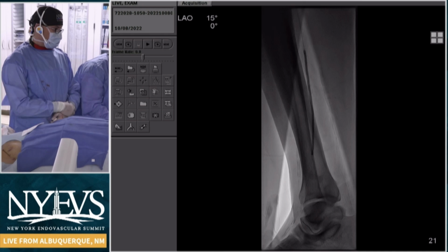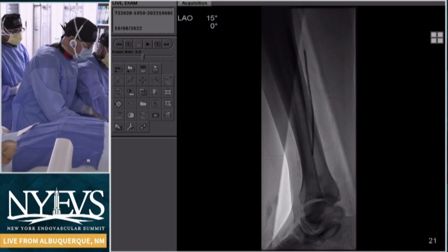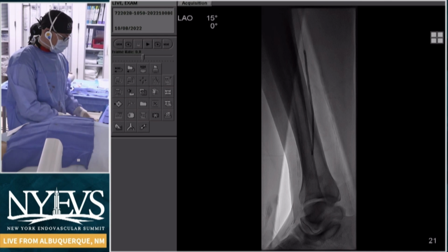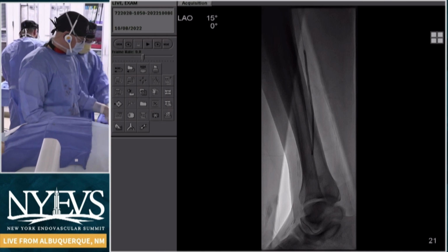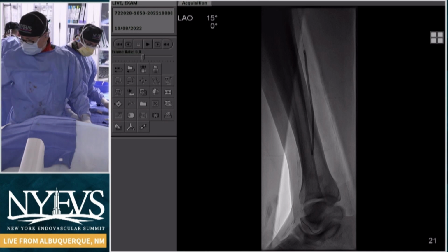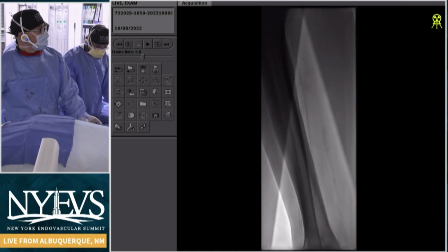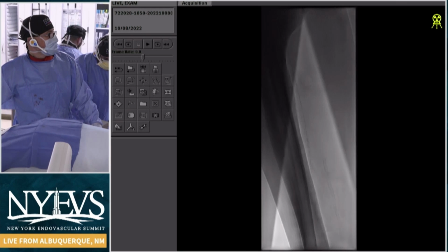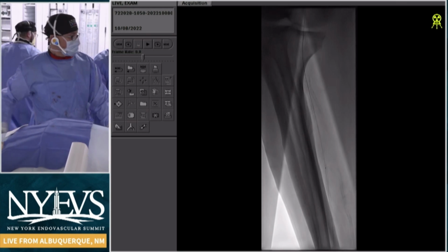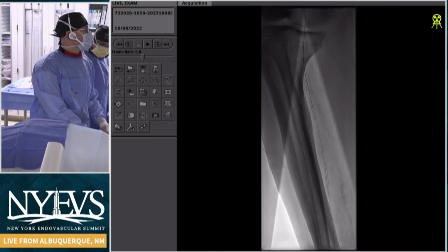We really have started to utilize PAT, as we're going to discuss later. It works well and has given us a good guideline. I'm big on staging a lot of this. If it's going to be over 2 hours or something like that, I'll stage it, bring them back, and then we can evaluate them in between and see if we even need to do anything else. Sometimes I'm surprised and those vessels plump up, and we're done, and we've done the job a little bit earlier than we thought.